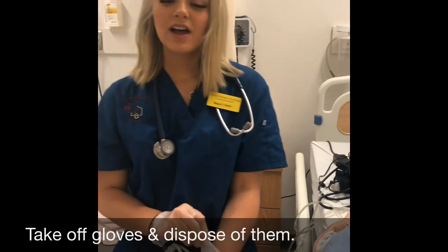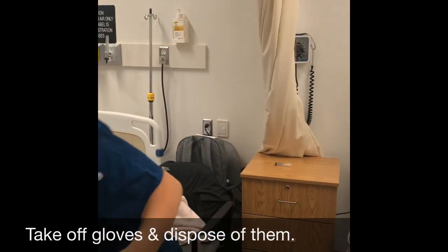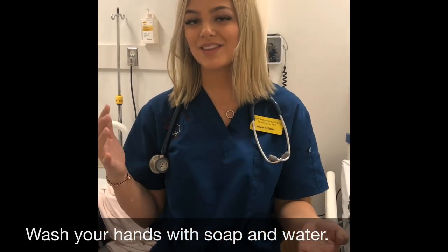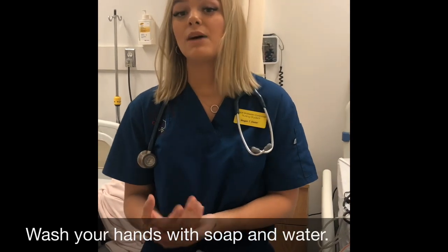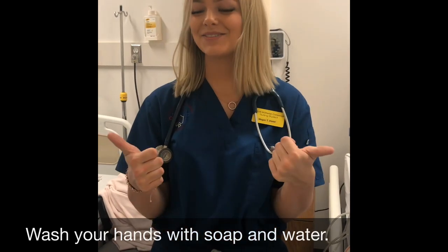Okay, so after that, I would take off my gloves and I would dispose of them. And instead of doing hand sanitation, I would go and wash my hands with soap and water. This is because you've been in contact with bodily fluids. So you just want to make sure your hands are free from debris and stuff. So it's really good to wash your hands.